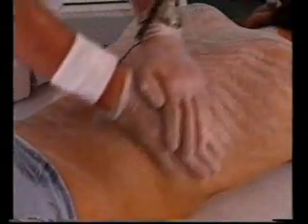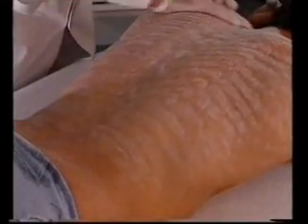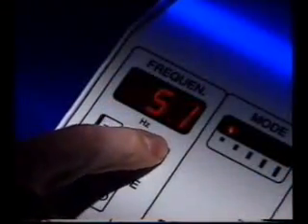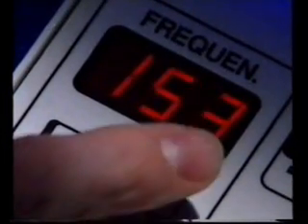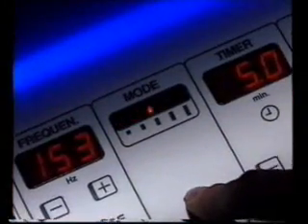Frequency equals the speed of the tissue deformation. Low frequencies provide a powerful pumping action with fluid displacement and are therefore suitable in the treatment of edema and pulmonary diseases. Medium frequencies have an intense detonizing effect and lead to a circulatory improvement in the tissue. Higher frequencies are very well suited to dissolve indurations and for pain relief.